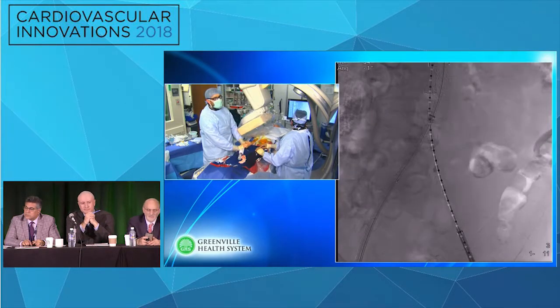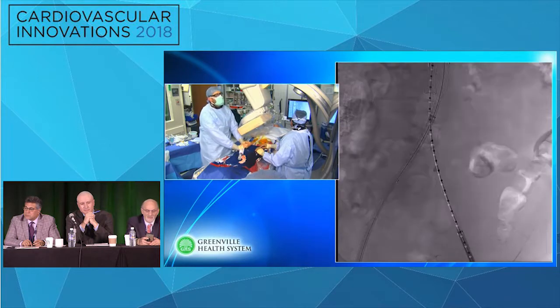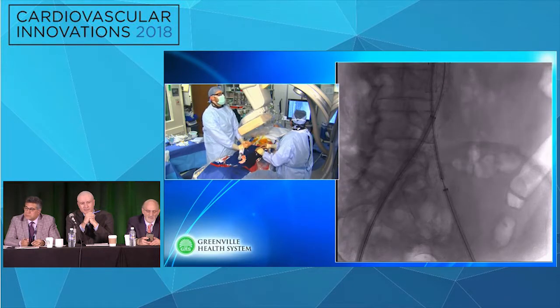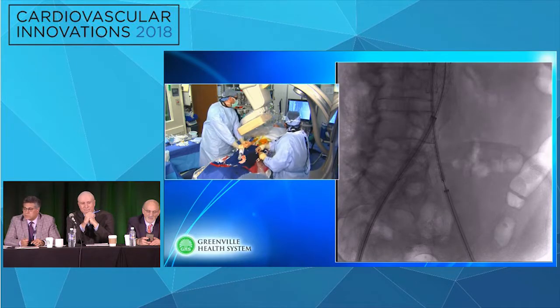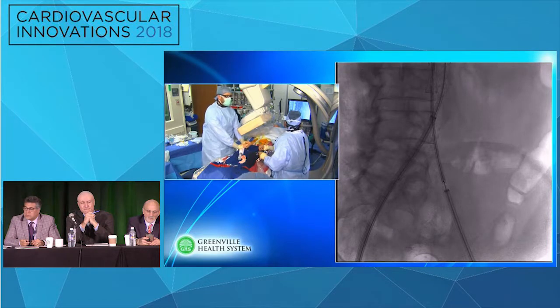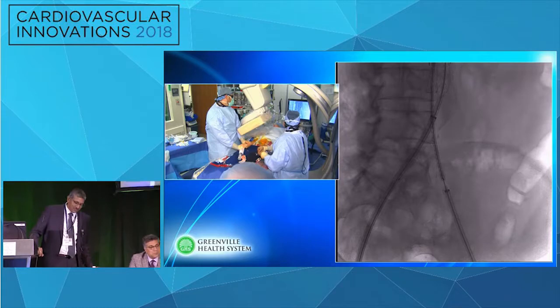Okay, come on live. It would be so good to have technology to mark it on fluoro on the screen digitally. I think that is one technology that is begging to be answered. There's actually a ruler you put under the patient. Yes, but you can move that. That's one way to do it.